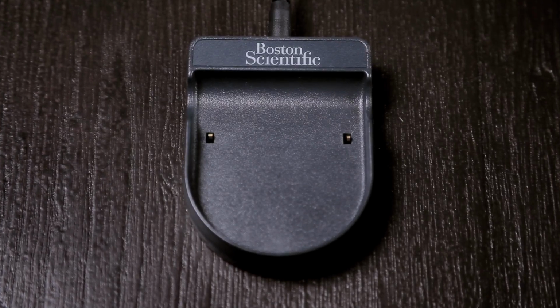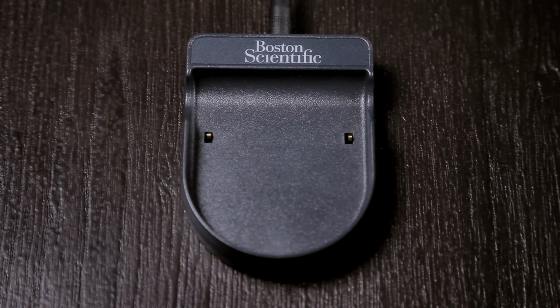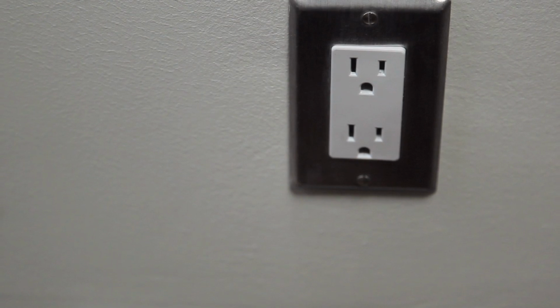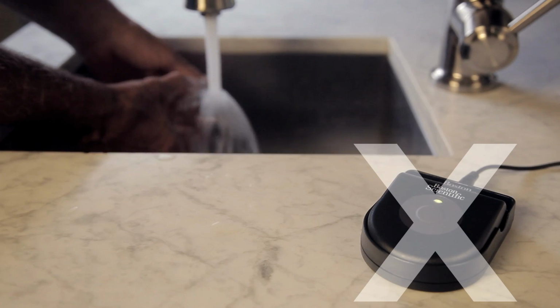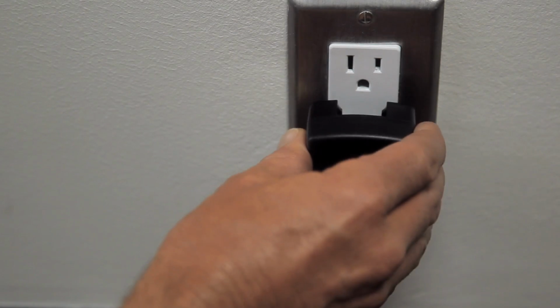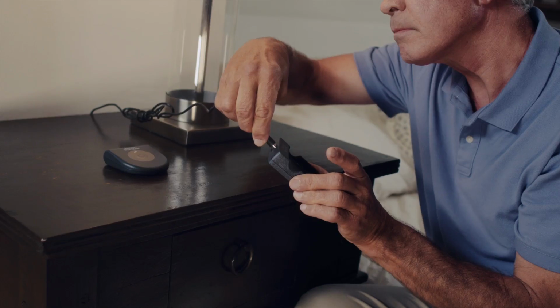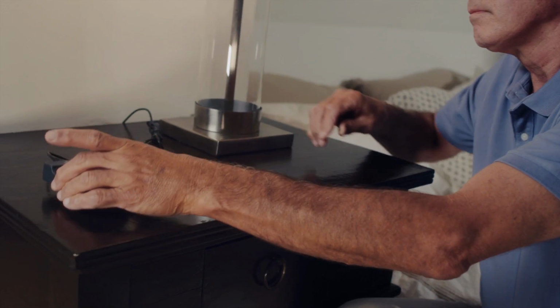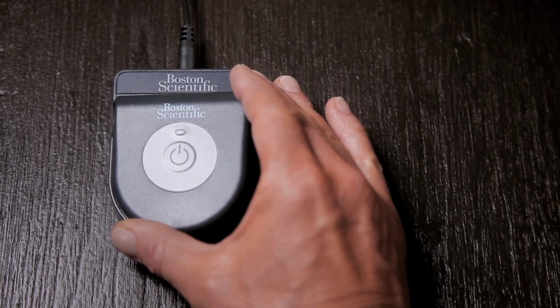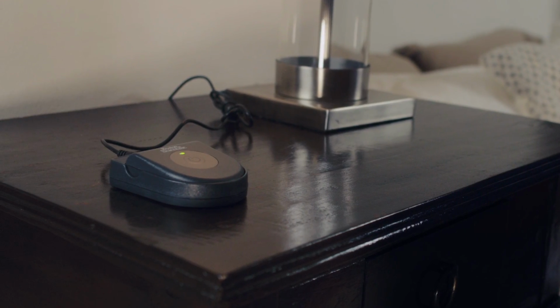To use the charging system, place the base station on a flat surface near an electrical outlet. Be sure it's not near water or direct heat. Plug one end of the power supply into the wall outlet and the other end into the base station connector. You may also consider using a surge protector as well. Then place the charger in the base station.